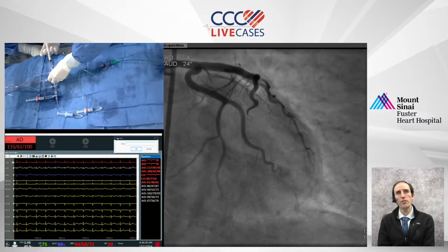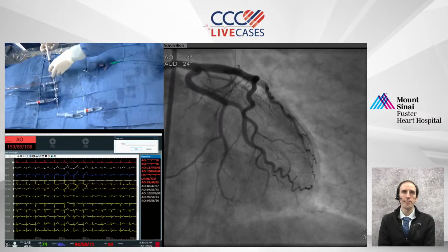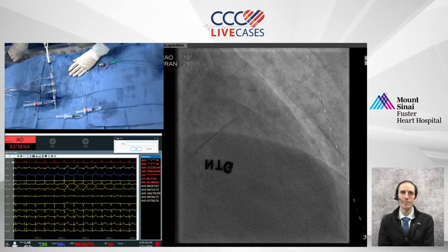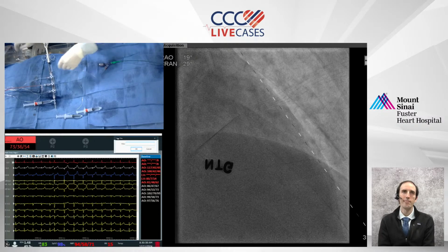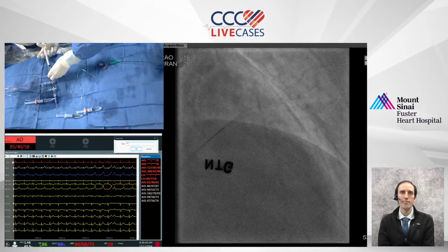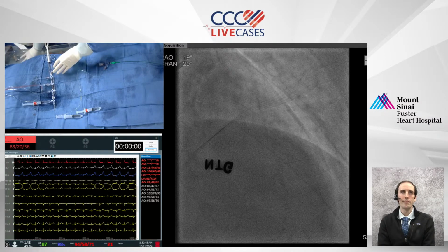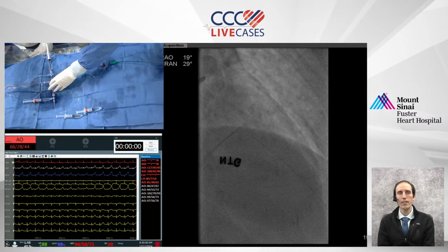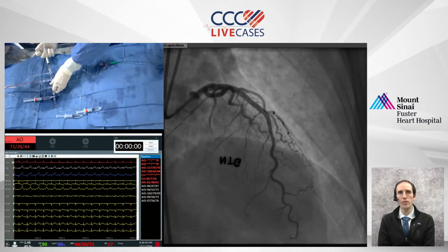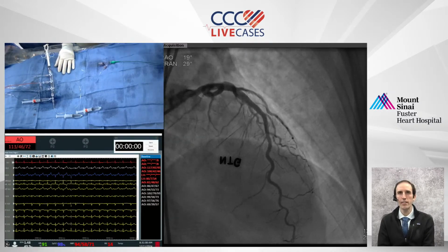Now, what's the purpose of giving nitroglycerin in this scenario? Well, one thing that I think we have to get better at diagnosing, and myself, is microvascular spasm. Could she have a degree of microvascular spasm here? If she does, then I'll reverse it. So when I move on to do my next testing, everything will be in order. That's right. That makes a lot of sense. All of the physiology studies were done with nitroglycerin preceding the testing. Correct. So you're going to have to give it anyway. This is as good a time as any to do it.